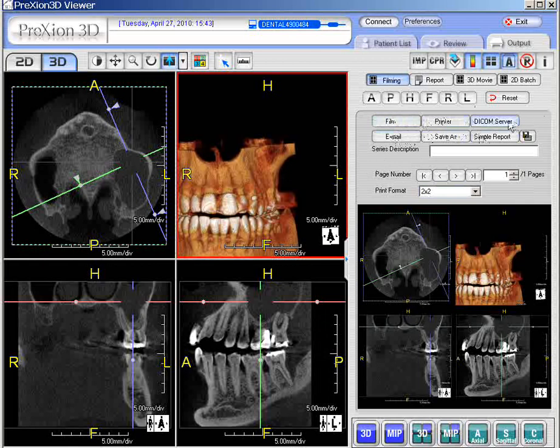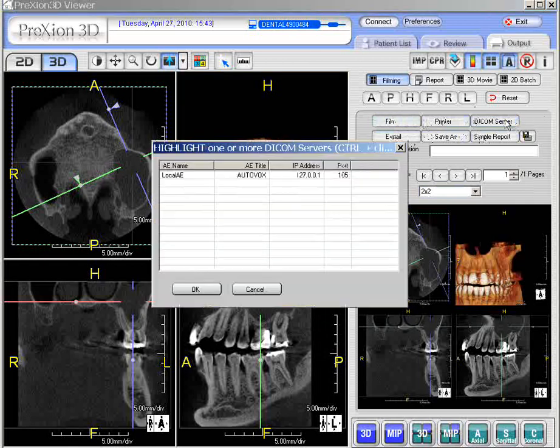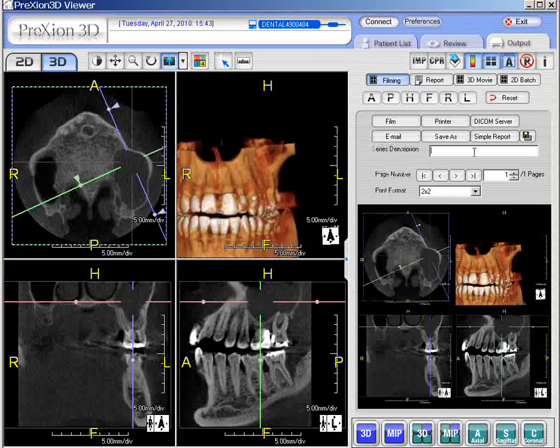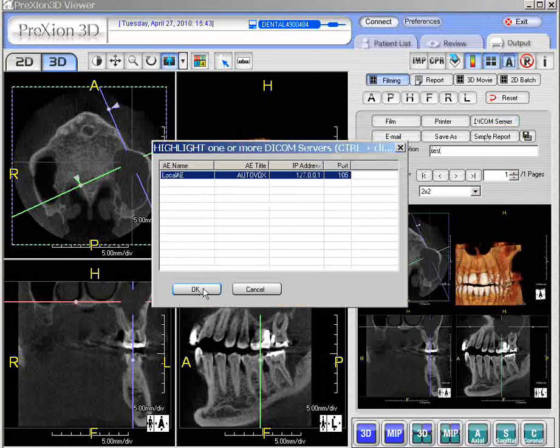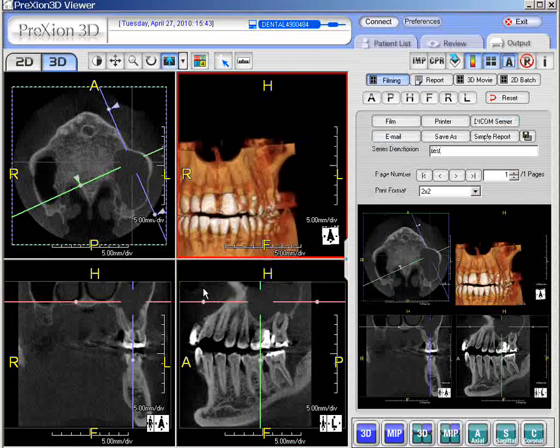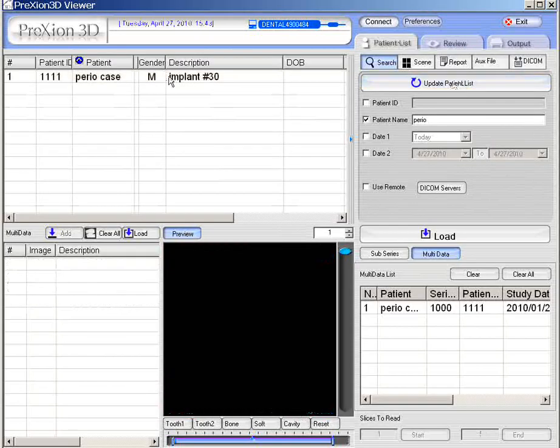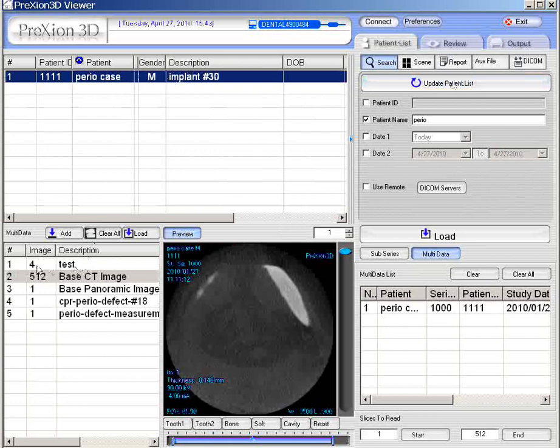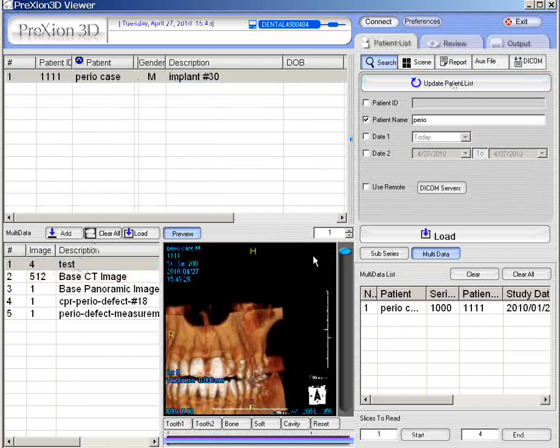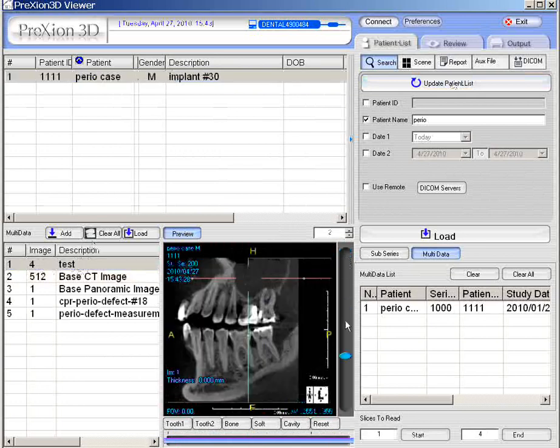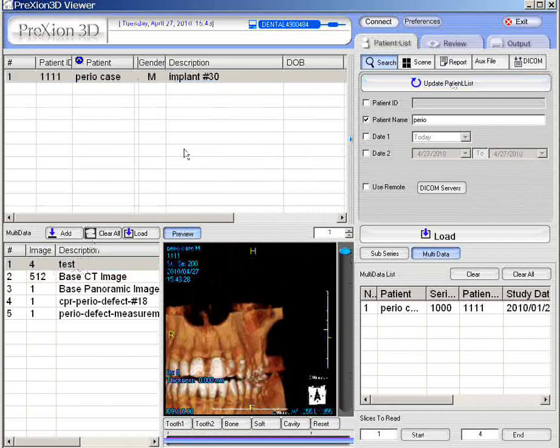If you go to DICOM Server, here's what you can do. First, set the series description — in this case we'll call it Test. Click DICOM Server and you're sending it back to the own PC, your own PC — sending it back to the patient list. After you've done that, go back to Patient List, click Update Patient List, highlight the name, and you'll see Test with four images. You can simply scroll down and see the individual four images that way.